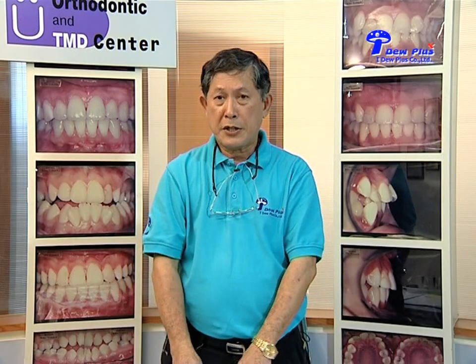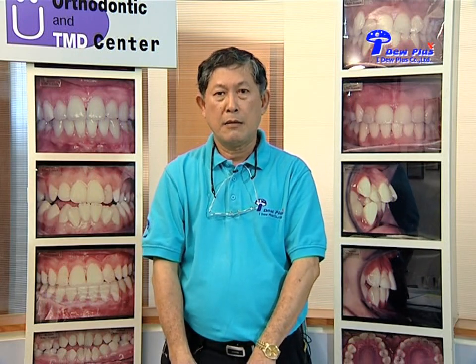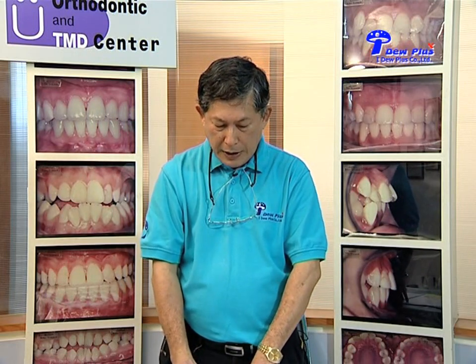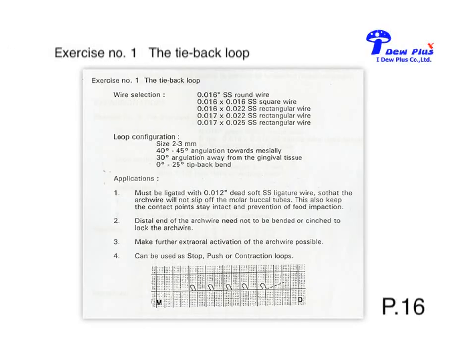Before we get started with the second order bend, I'd like to introduce you to the extra element. The extra element is most of the time the loop. We use the loop to do many tasks. As you can see here from page 16, exercise number 1 is the tie back loop.